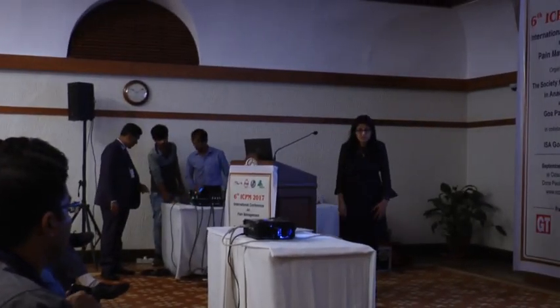So I'm just going to demonstrate the supraclavicular and the interscalene brachial plexus block on the volunteer. All right, so while Sunita is setting up the probe and machine, any questions so far?